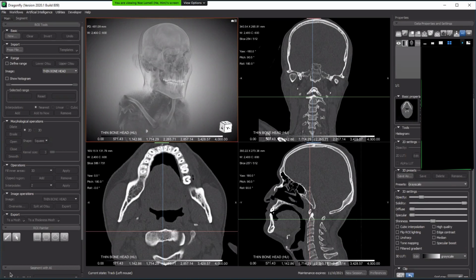Yeah, I'm interested in the volume, but the problem is it's not real tissue there. It's just the virtual space of the nasal cavity, I guess. I think it's okay. We are able to get the cavity even if it's a low intensity area. So I think we can try the deep learning now.